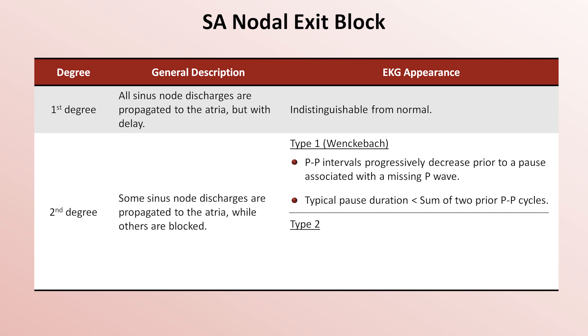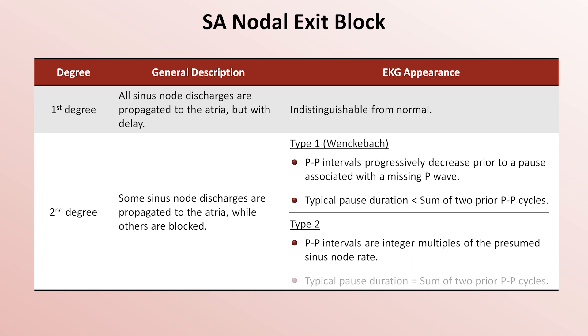In type 2 second degree block, the p-p intervals are integer multiples of the presumed sinus node rate. In this case, the typical pause duration is equal to the sum of the two prior p-p cycles.